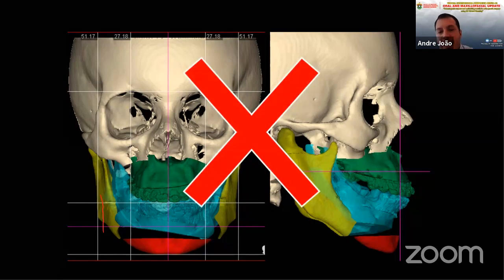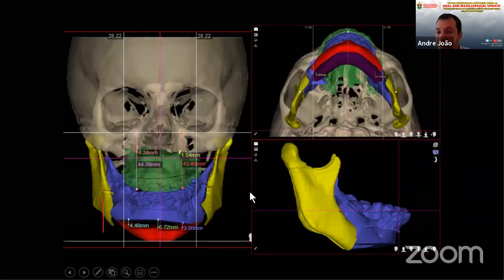So I changed my plan. Unfortunately, I usually plan this case early, but I took all the scannings, the CT scanning, the surface scanning, just a few days before surgery. Everything was ready, the patient was ready, and I had this dilemma: what am I going to do? If I leave this patient in occlusion, I would cause a huge mandibular asymmetry. So I changed it a little bit.